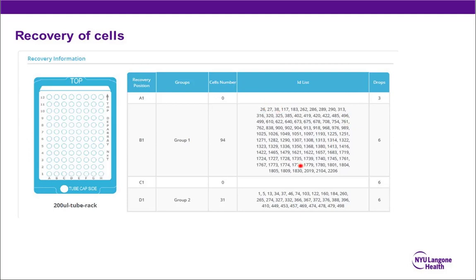Each of the cells carries a specific barcode. Of course, when you're dropping them as a pool, that is not particularly important, but once you start thinking about single cell analysis, because you know for every PCR tube what the barcode of your cell is that you dropped in there, you can then go back to your images and compare, let's say, your low-pass whole genome or mutation information for every cell that you drop with that particular image, and then you can start doing some interesting analysis on how morphology and genetics interact with each other.